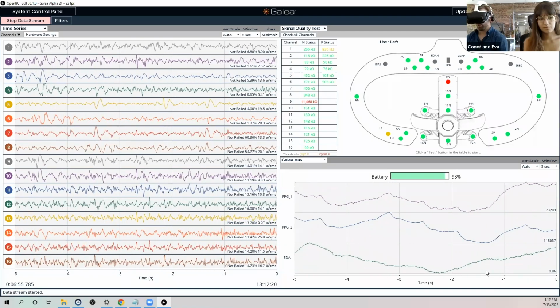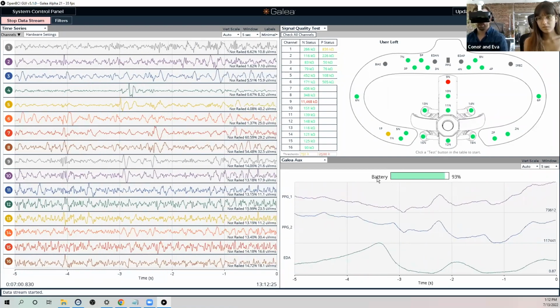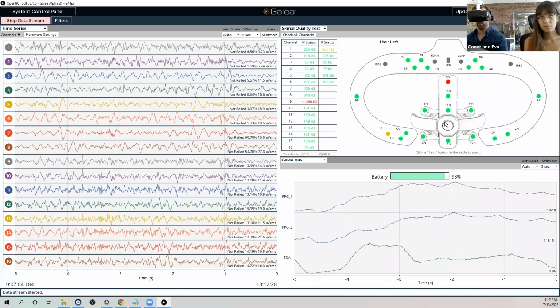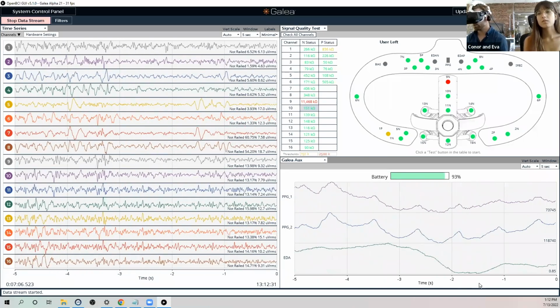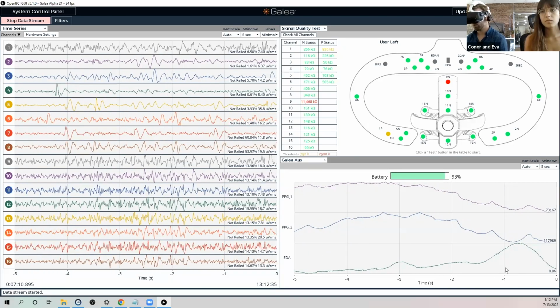So in theory, over time, as I start to relax and as we get further into the talk, this would plateau, and then you would see more typical rises and falls that correspond to shifts in my alertness or anxiety.